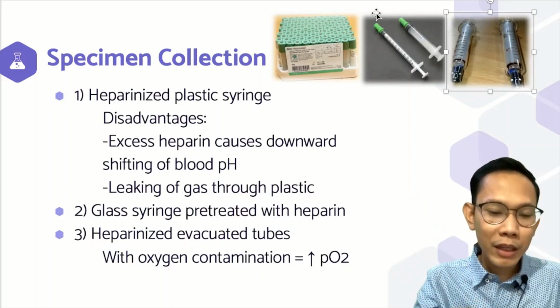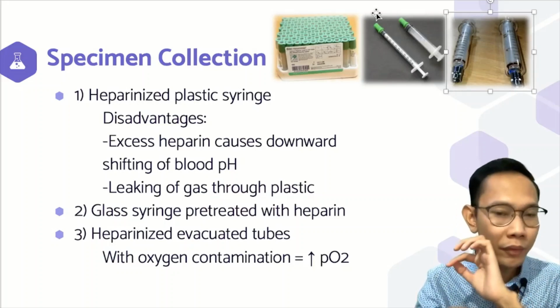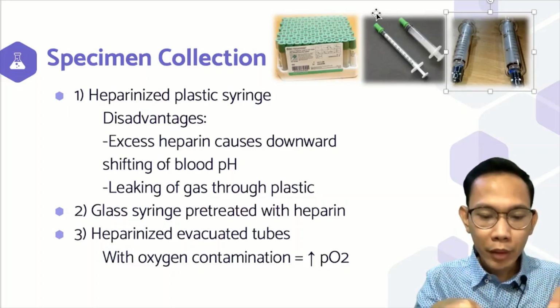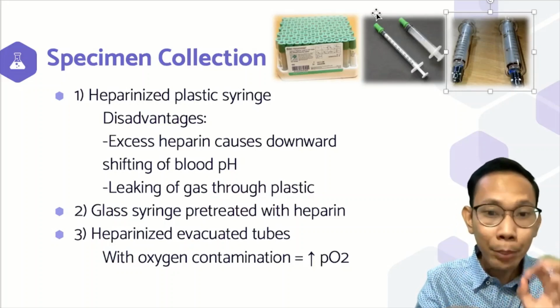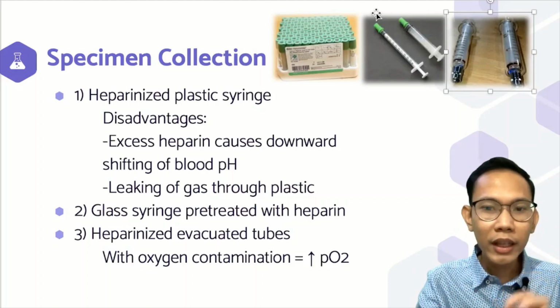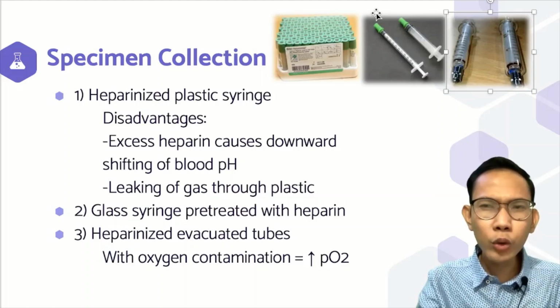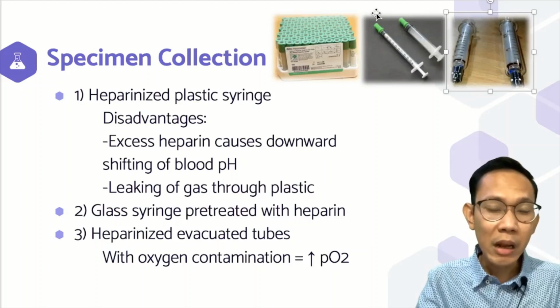And then, pag pull mo lang ng syringe, usually, ang sobrang bilis lang talaga. You have to really determine nga, it's really arterial blood. And it's really bright red. It's easy to pag-check mo, bright red, di siya arterial, gini siya. It's really difficult. Sometimes, depende kasi sa location kung saan ka nagko-collect, no? Kung usually, kung dehydrated ang patients, medyo mahirap din mag-collect ng arterial blood sample.